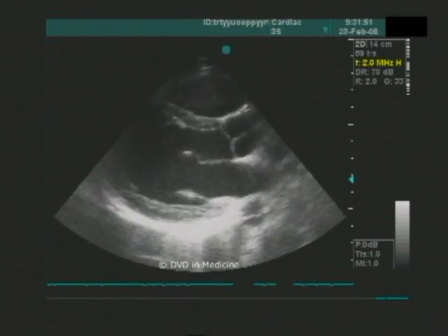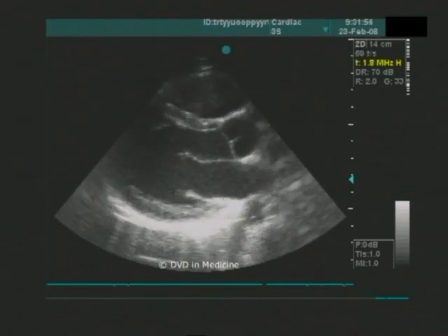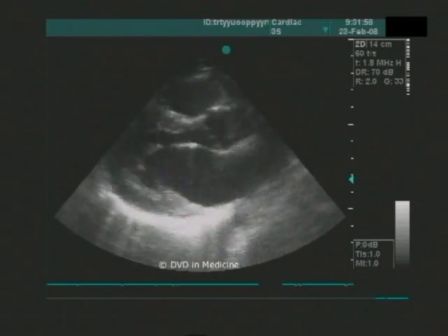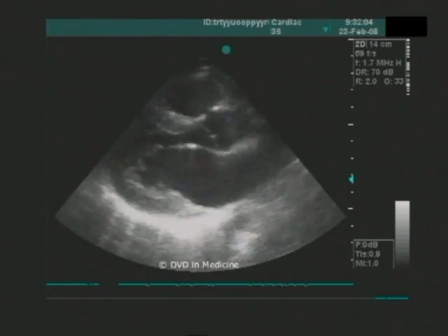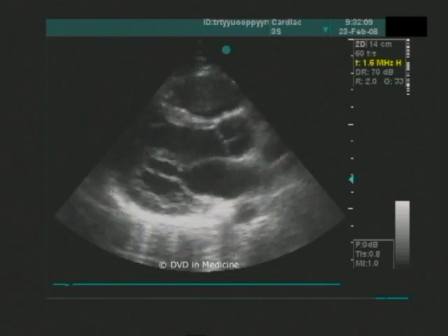In this clip, we demonstrate how the real-time ultrasound image will change with step-by-step reduction of the transducer frequency. The image resolution decreases and the anatomic details become rougher. However, the image's contrast is enhanced thanks to better ultrasound penetration.